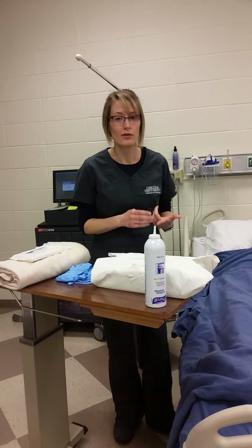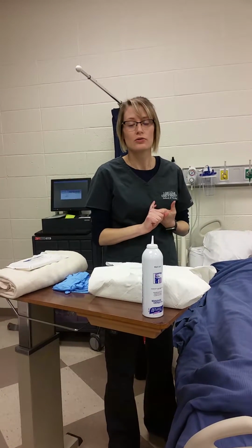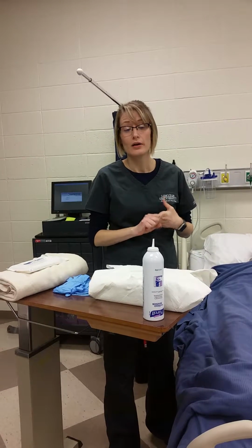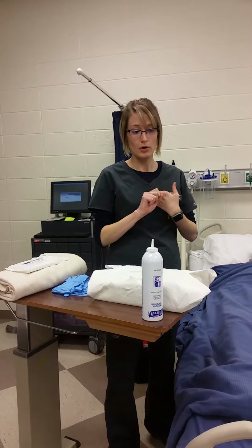assess my patient. I want to know what their level of consciousness is, if they have any drug allergies, especially to latex or iodine. I want to know when they last voided, and I also need to assess what catheter size they need. And then I would go and gather my equipment.